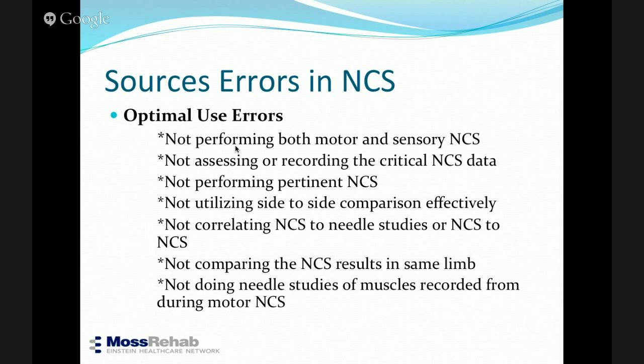If there's pathology, then you'll have to be able to define it. So if this is in mid-range, this will be in mid-range. If this is in the low range, this will be low range if it's normal, right? And if this is in high range, this will be in high range. But if this is in high range and this is in low range, then there has to be a pathological problem.